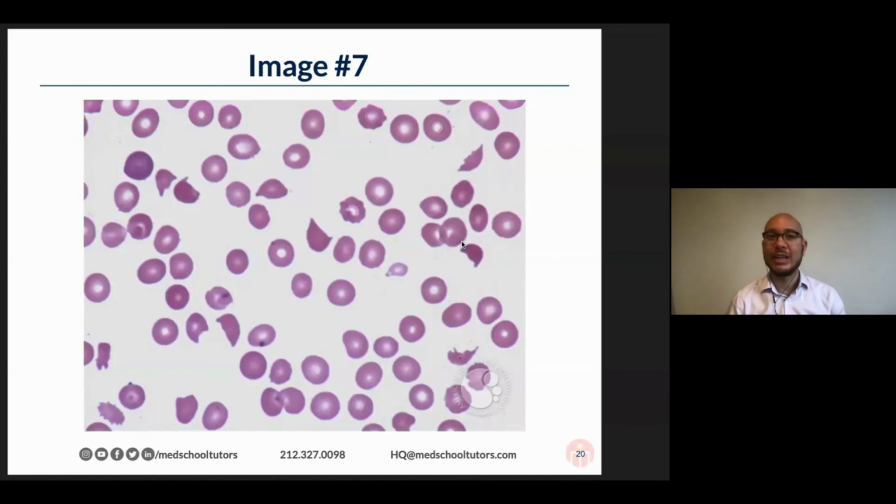But you can also have macroangiopathic hemolytic anemia. And just as the name implies, macro, big. That's abnormal blood flow across a valve, for instance, a valve prosthesis, as someone in the chat was pointing out. Beautiful. And the last point I'm going to question you all on, TTP is a very classic cause of schistocytes. And I want you all to put in the chat, what is the protein that is abnormal in TTP? Beautiful, ADAMTS13. You all are too good. I can't get anything by you.